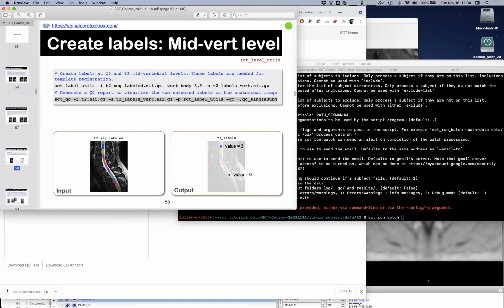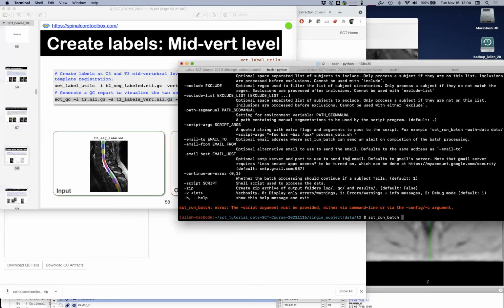Could you maybe comment? Yeah, sorry, I just noticed when you were running the command before that it used nearest neighbor interpolation when it warped back. I've been reading some posts about interpolation for labeling, and I was just wondering if you used a different one, or do you wrap antsApplyTransforms in SCT, or is it your own command?